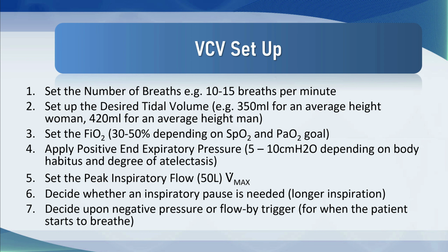And finally, decide what type of trigger mechanism to use, whether it's negative pressure triggering or flow-by triggering, for when the patient inevitably starts to breathe. In this day and age, it is conventional to use flow-by triggering, as I discussed in tutorial number 2.